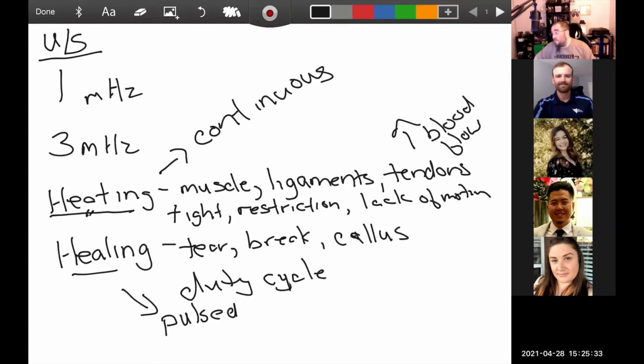Pulsed is going to work a lot more along those really high level, the microjet and the cavitation line, right? Of causing those water flows to occur, that if you read your book, they went way far in depth into it. And you probably looked at it and just got all glazed eyes and went, I have no idea what they're trying to say there, right?